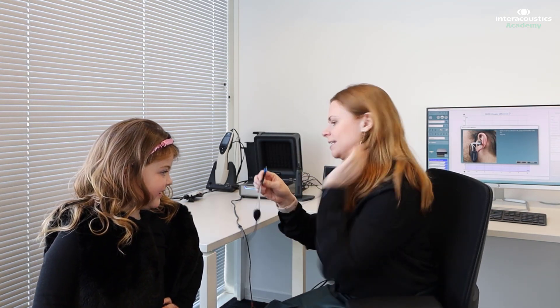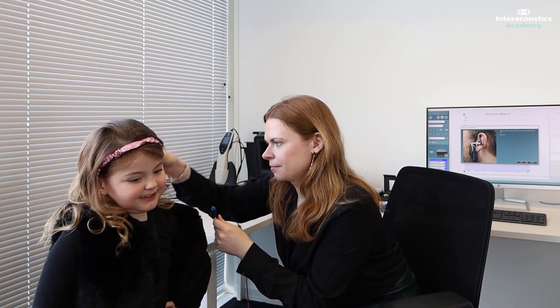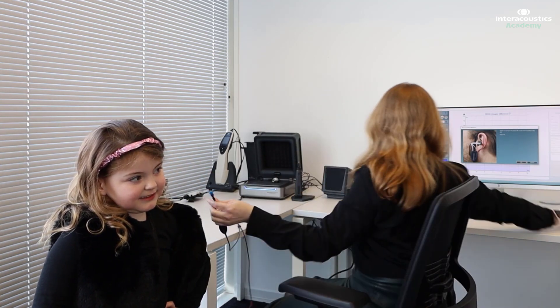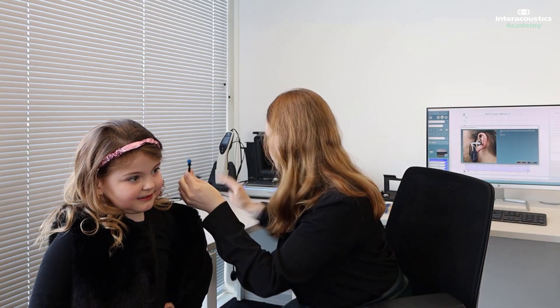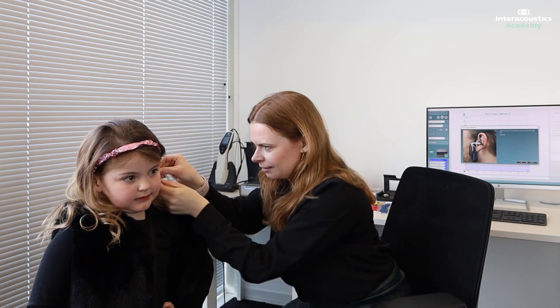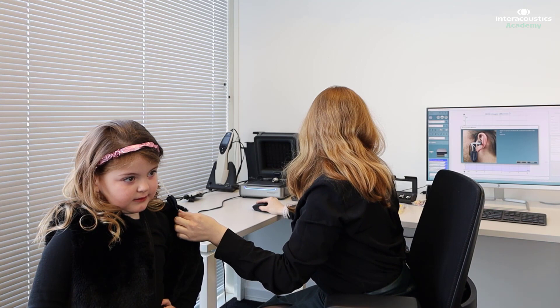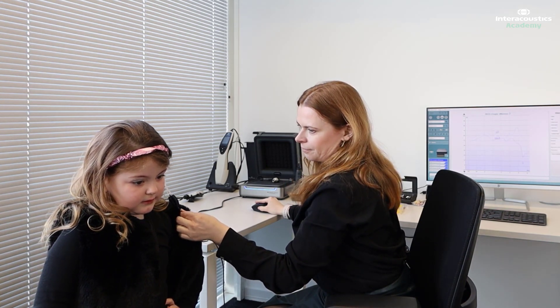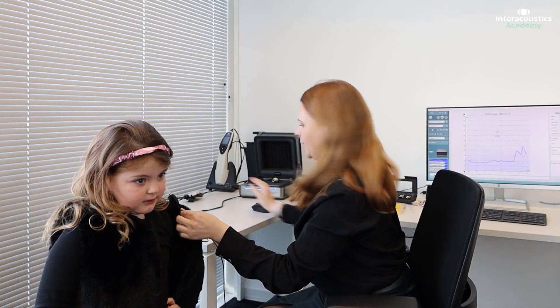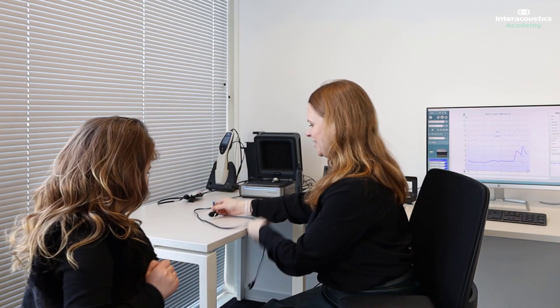You'll hear a funny sound — it's going to take one, two, three and then we'll take it out and we'll be done. Just move your lovely hair out of the way. Here we go — a little tickle in your ear. Good job. Fantastic. Well done. That was it — give me a high five! Good job.